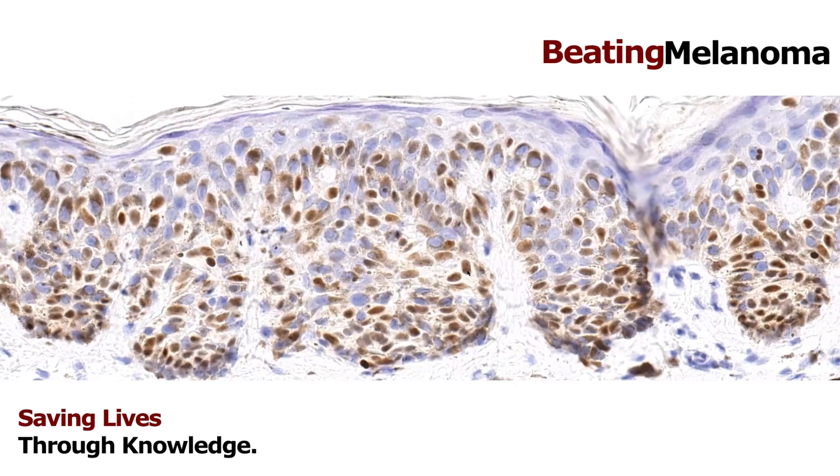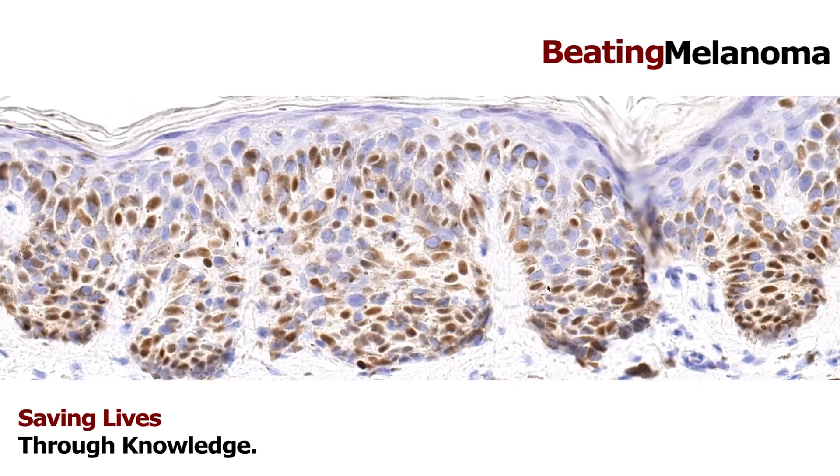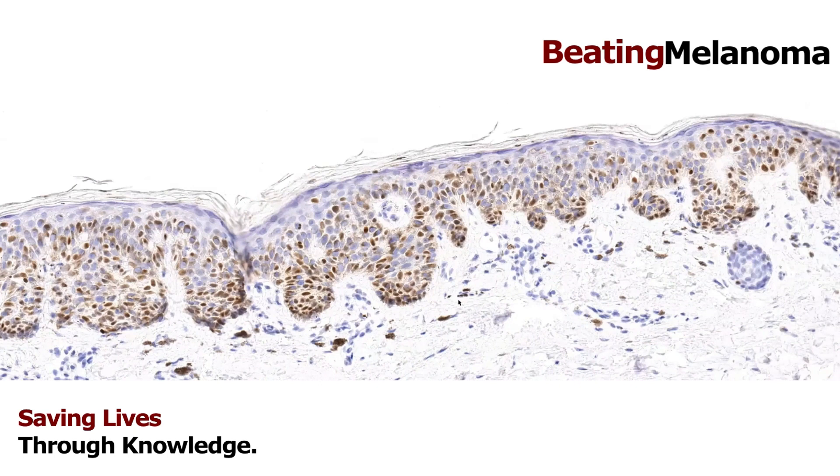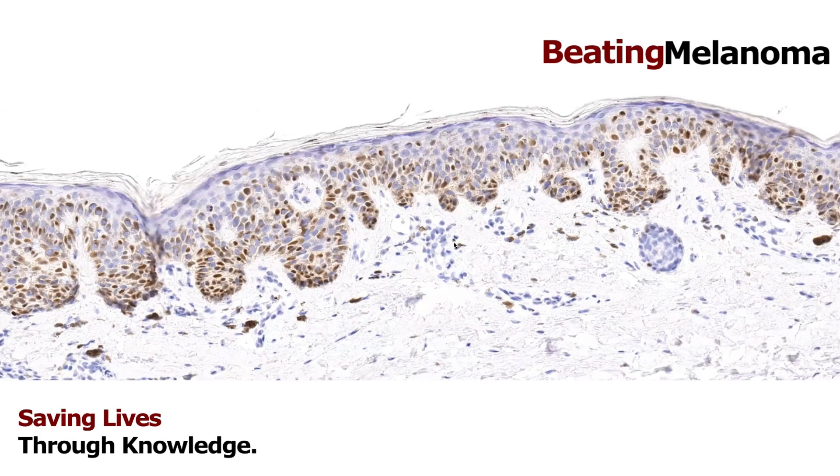This PRAME stain can be helpful when we're on the fence — not sure if something is a really atypical nevus or actually melanoma. Doing the SOX10 or MART-1 stain can help, and doing PRAME can also help. Here, all of the brown nuclei are the melanocytes, and most of them show pretty strong expression of PRAME — that's a pretty good sign it's probably melanoma. It's not perfect: nevi can sometimes express PRAME and some melanomas can be PRAME-negative. But it's a really helpful tool in certain situations, and that's where the experience of being a dermatopathologist comes in — knowing when this will really help.